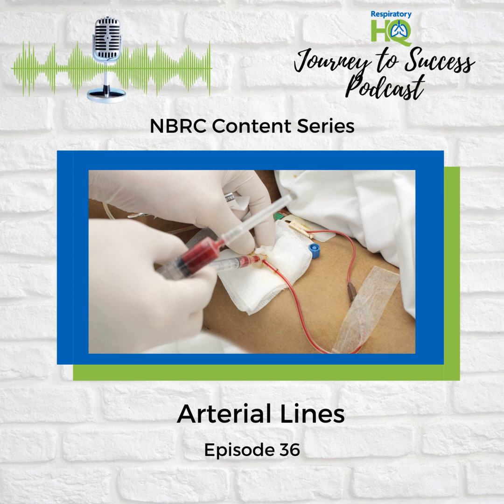And on the other hand, low blood pressure, hypotension, would make the waveform lower and flatter. So the waveform is like a window into the cardiovascular system. It is. It's like a secret code that doctors can read. Exactly. Skilled clinicians use those subtle clues in the waveform to make important decisions about patient care. It really shows the power of this technology.